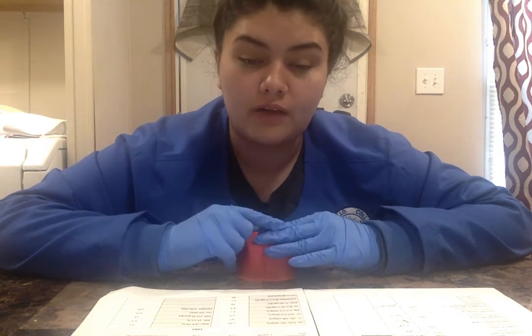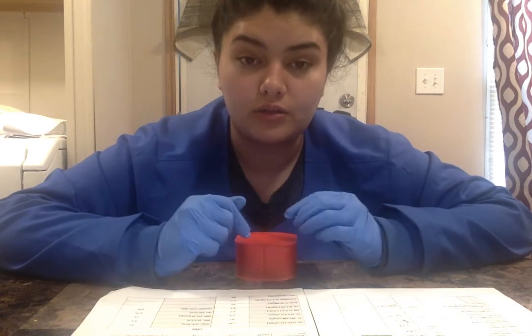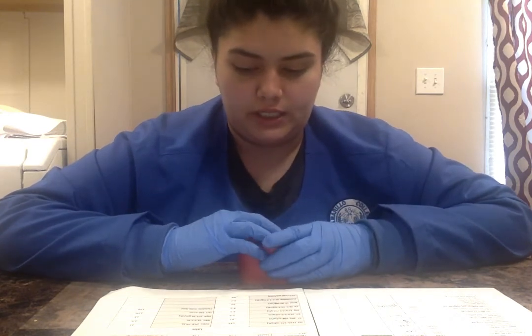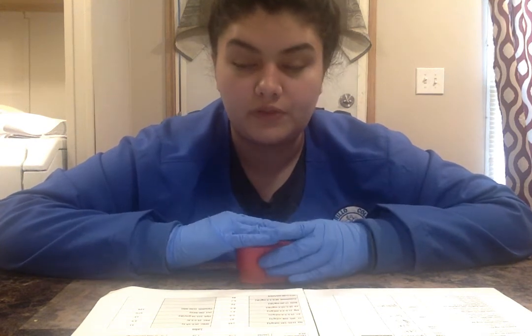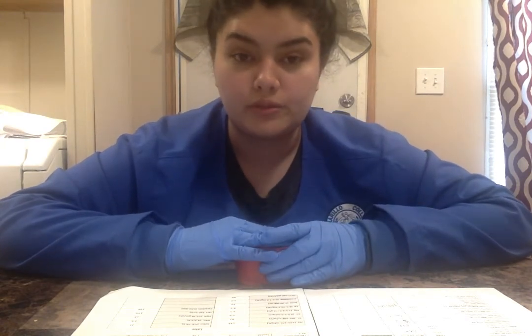I'm gonna evaluate how effective my insulin was by checking her blood glucose again to see if she's in between a 70 and a 100. And like I said, I'm going to make sure that she's not showing any signs or symptoms of hypoglycemia. And if she was, I'll give her hard candy or juice.